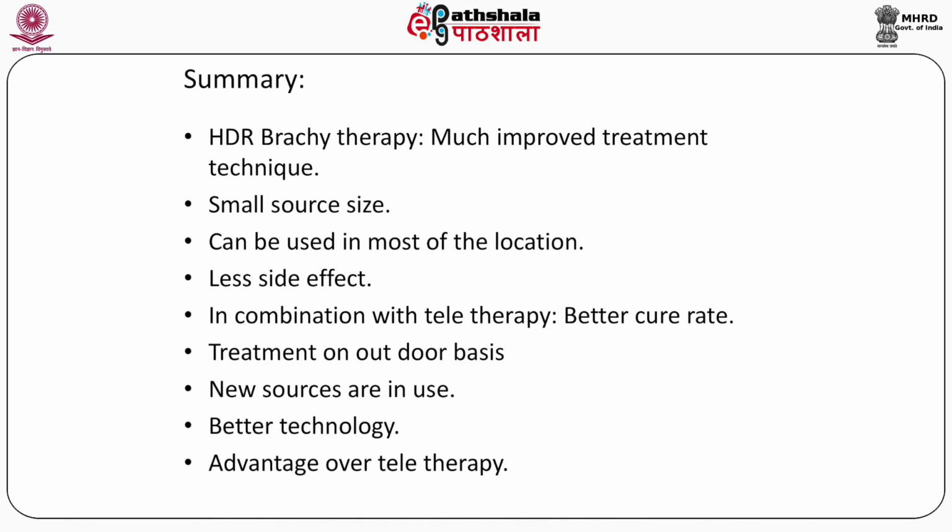Advantage over the teletherapy is because we are placing the source close to the tumor, so high dose can be delivered to the tumor.